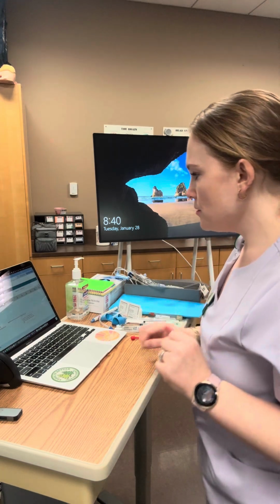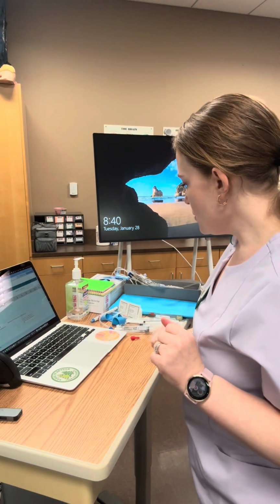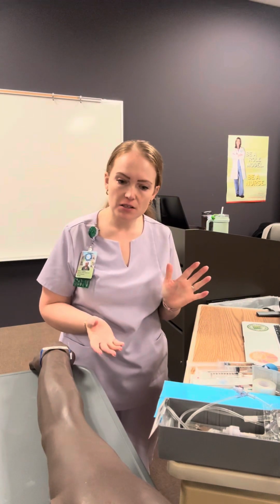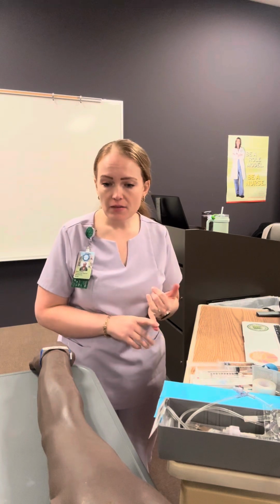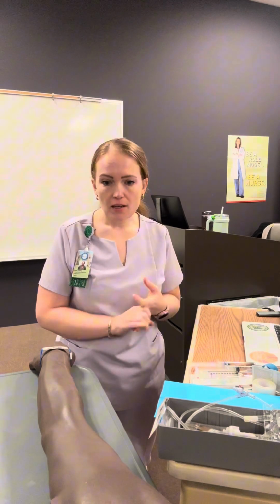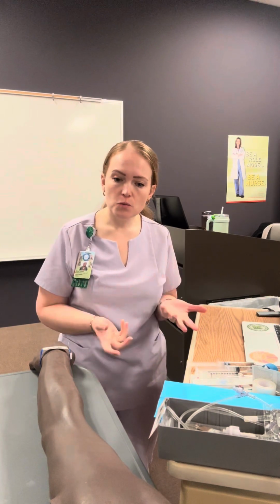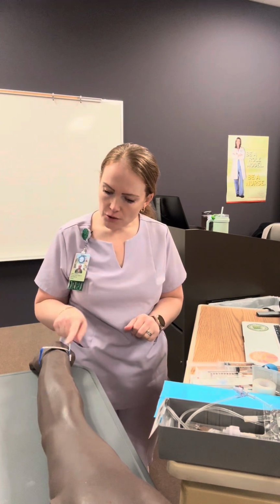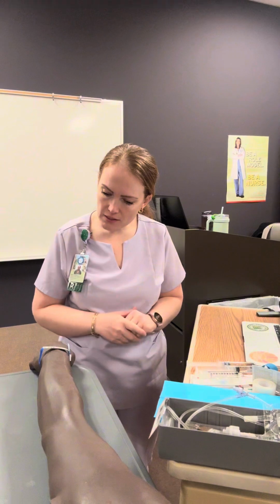I am going to go into the patient's room. Hi there, my name is Sadie. I am a CVCC nursing instructor. I am here today to insert an IV, draw some labs, and start a bag of fluids on you. Will you tell me your name and date of birth, please? All right, Mr. Code Brown, Miss Code Brown, 6/18/51.